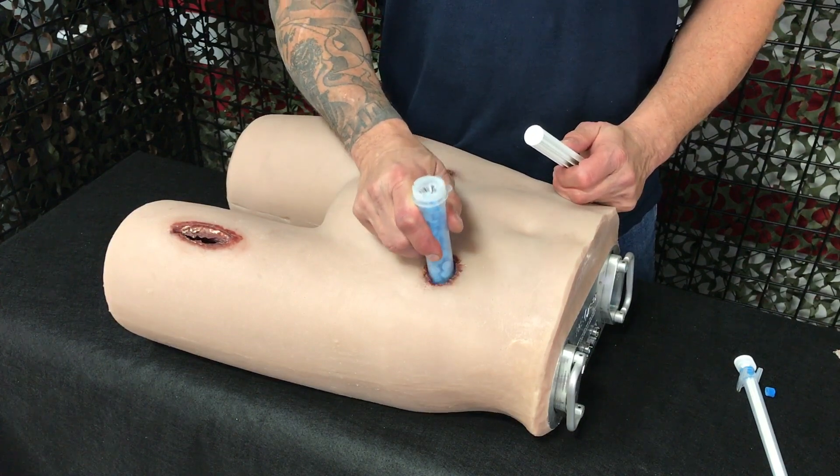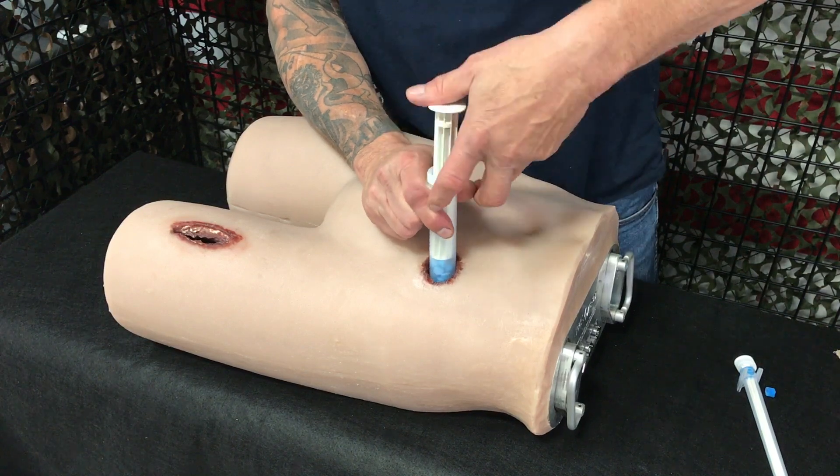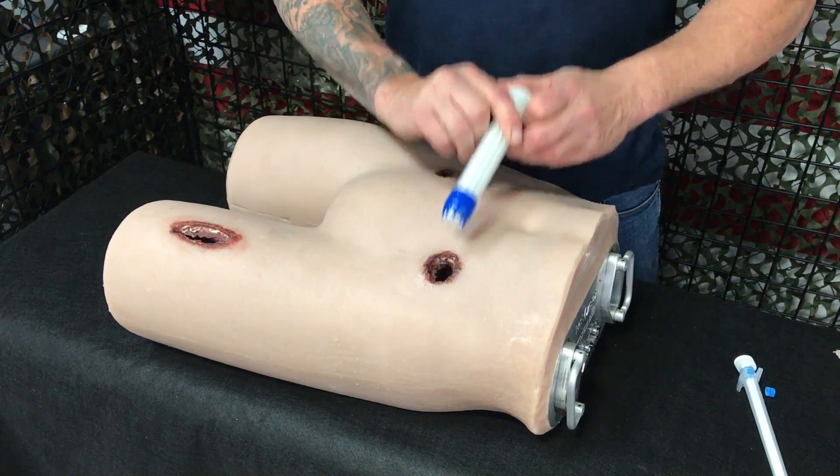In a very large wound, you can use additional applicators as necessary to completely pack the wound with mini sponge. Finally, cover the wound with an occlusive or pressure dressing per your standard protocol.